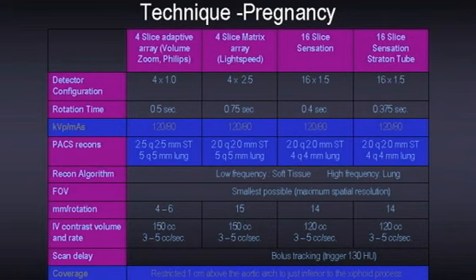We also perform CT pulmonary angiography in pregnancy. In our particular department, we reduce the radiation dose exposure and we limit the examination to just above the aortic arch to the level of the xiphoid process. We never perform CT venography in these patients for obvious reasons.